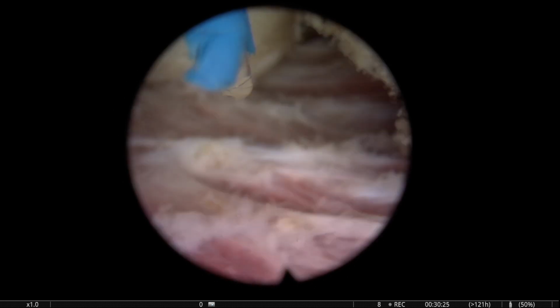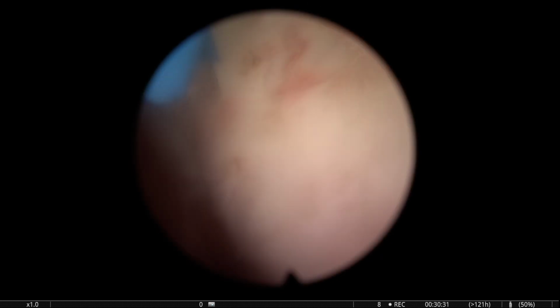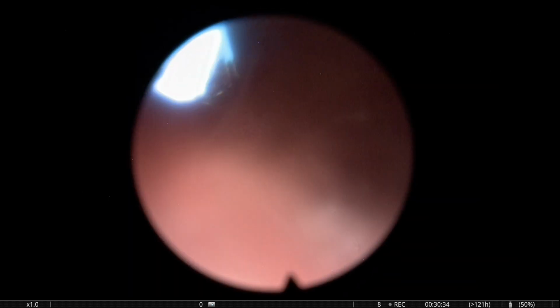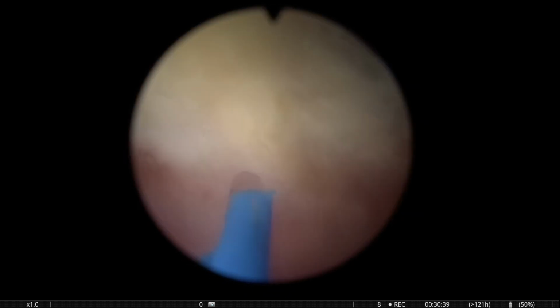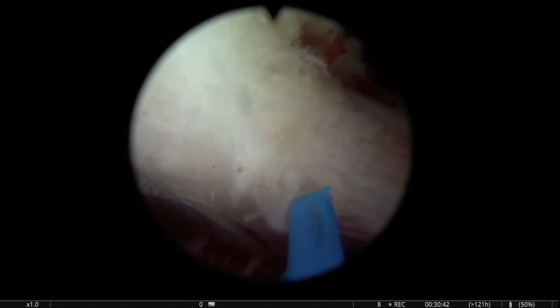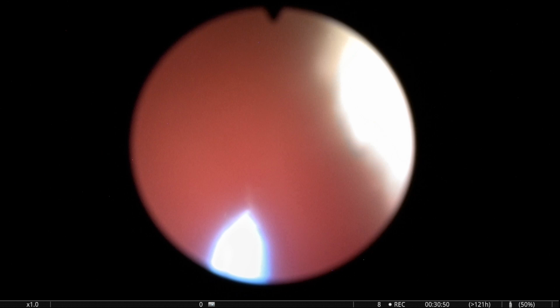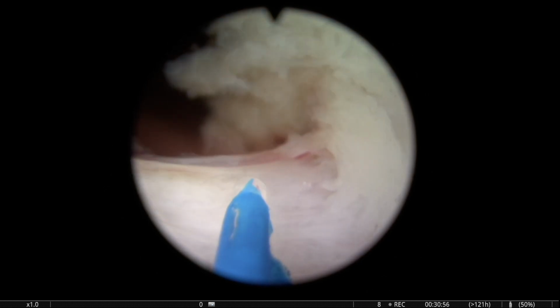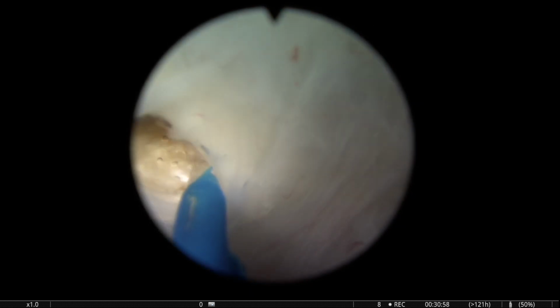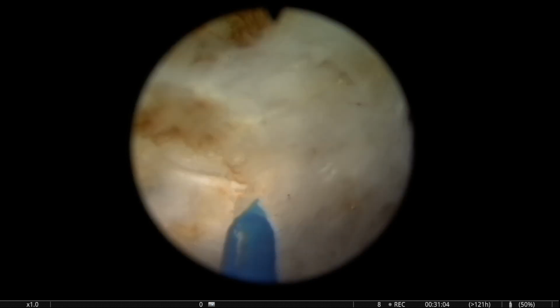In many instances, we can elevate the lobe and flip the adenoma. Sometimes we flip one lobe first, and here at the end, sometimes I find it easier to use the fiber at 6 o'clock. You see, that's the UO. So we are okay, and if we go to the other side, check for the bladder neck. That's the UO on the other side, and now we can finalize the liberation of the 6 o'clock attachment, trying to follow the curvature of the bladder neck.